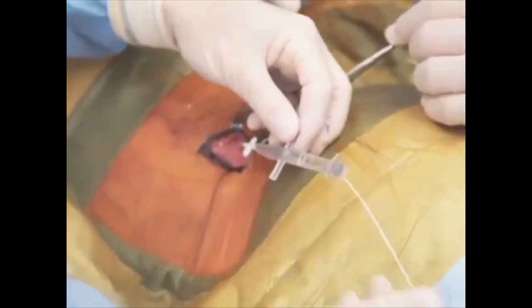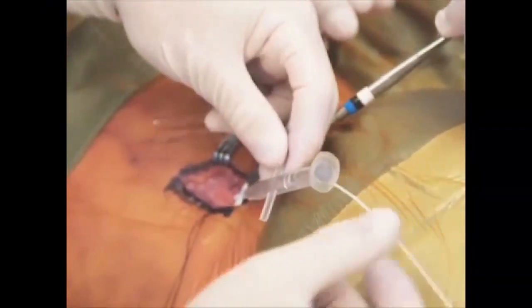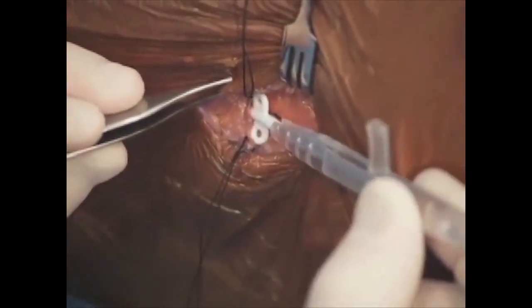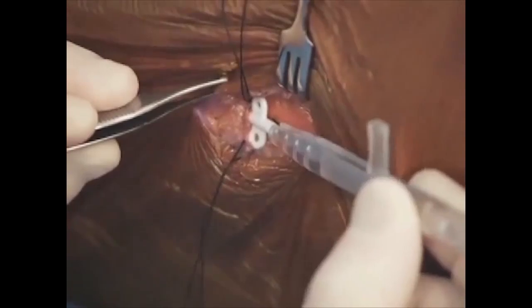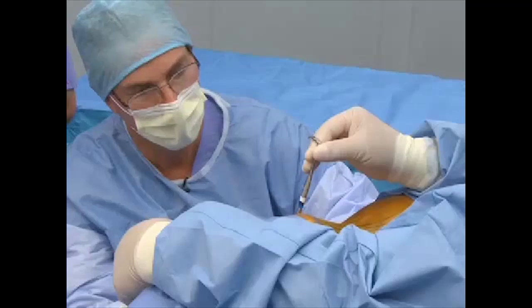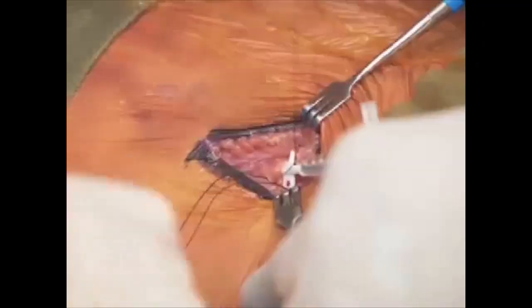With one hand, grasp a portion of the catheter that exited the anchor dispenser, and with the other hand, use the dispenser to gently slide the anchor towards the fascia entry point. Continue until the leading end of the anchor touches the fascia entry point. Push on the top ridge of the dispenser handles until the leading edges of the anchor wings touch the fascia. Note that you should not dispense the anchor at this point, as the anchor cannot be repositioned once it has been released by the anchor dispenser.